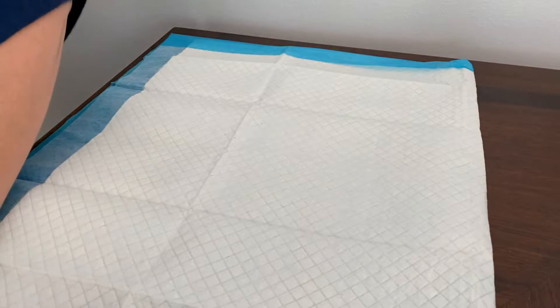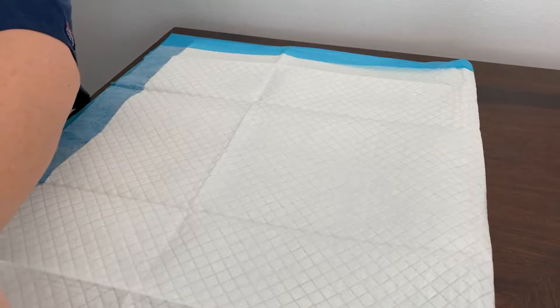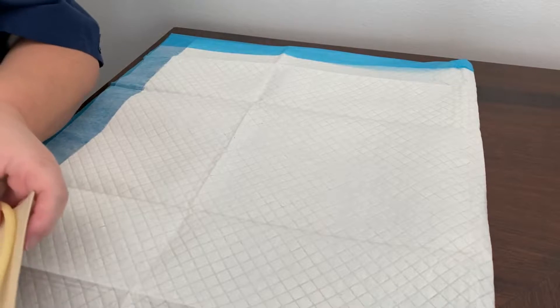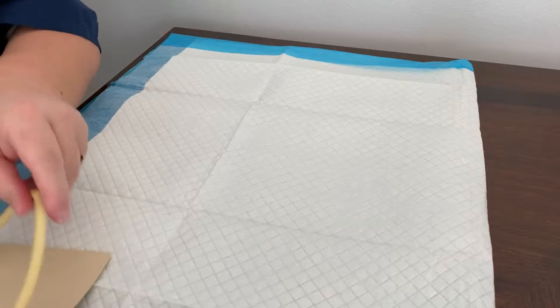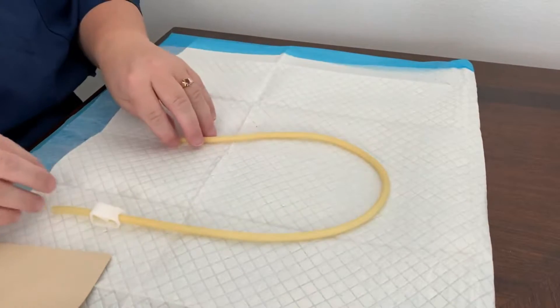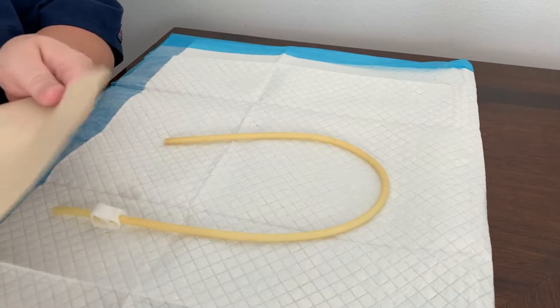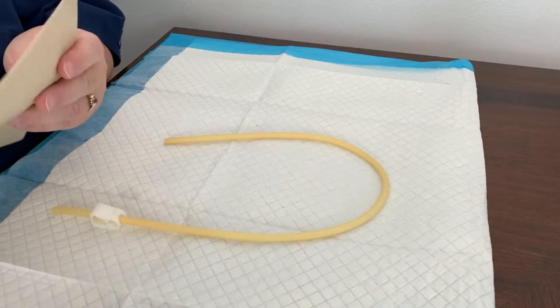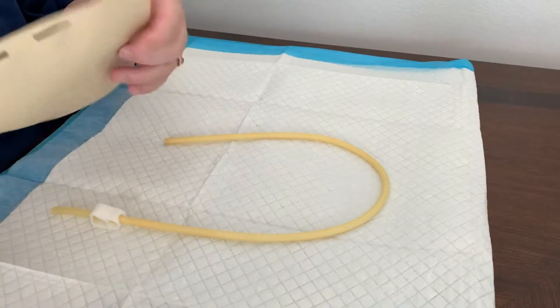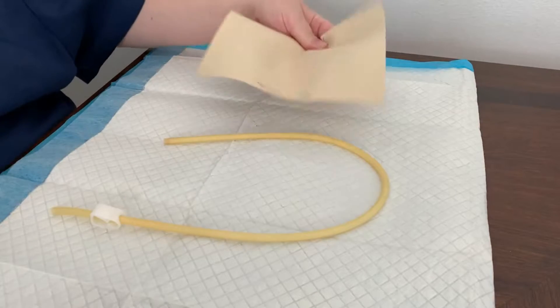Today I'm going to show you how to make an IV kit or a blood draw kit that you can do from home. The first thing you're going to need is some rubber tubing. You'll also want a piece of synthetic skin — this is tattoo practice skin, and it works great.